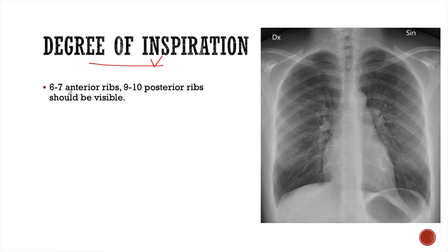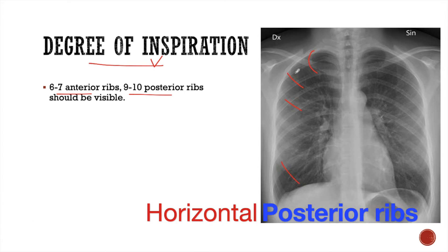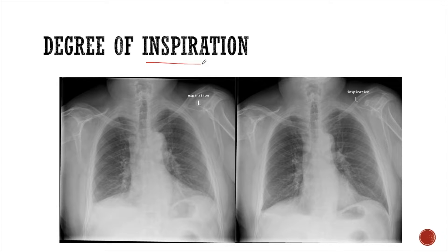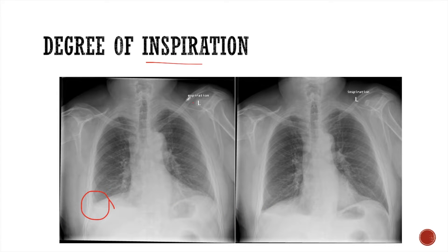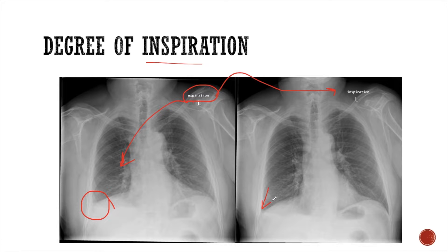The next factor is the degree of inspiration. If inspiration is adequate, six to seven anterior ribs and nine to ten posterior ribs should be visible. The oblique ones are the anterior ribs and the horizontal ones are the posterior ribs. When inspiration is not adequate, the costophrenic angles may appear blunted and mimic pleural effusion. In an expiratory x-ray, there is blunting of the costophrenic angle, but when the patient takes an adequate inspiration, the costophrenic angles are sharp and there is no pleural effusion.